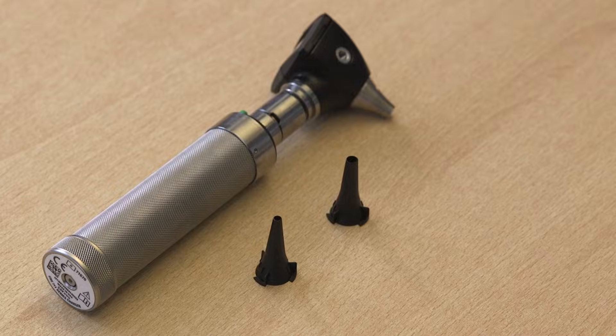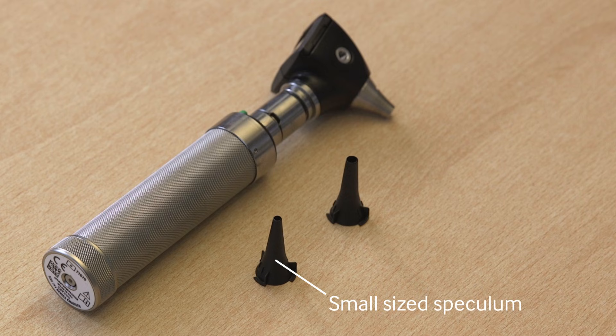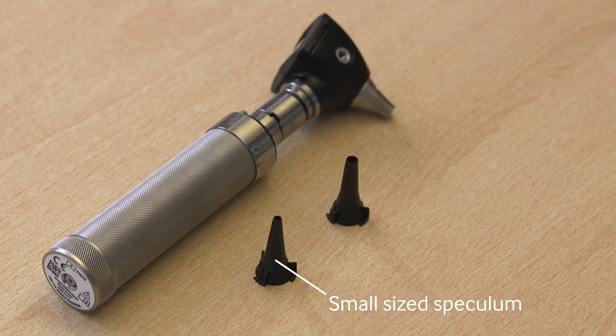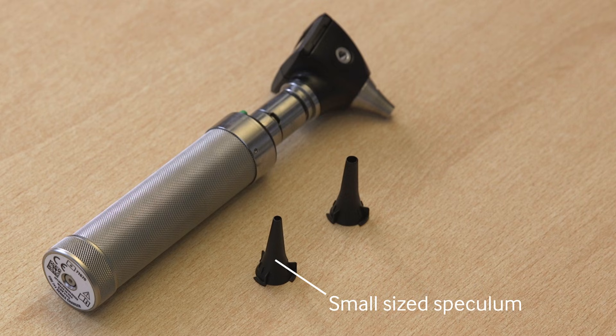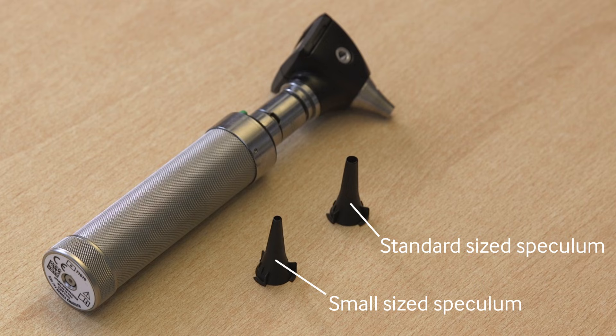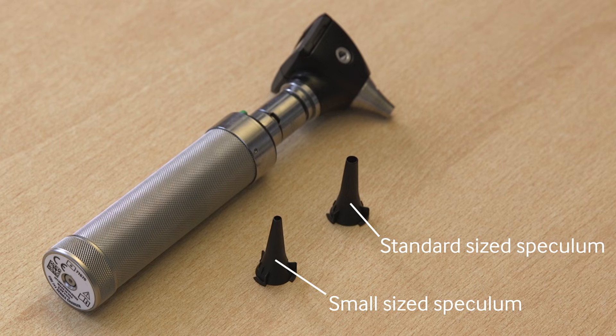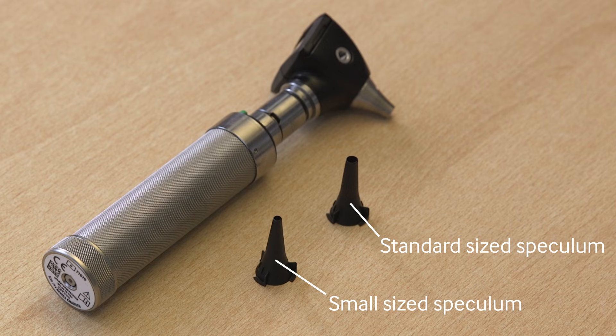There are two speculums available: there's the small one, which is ideal for children or for adults with narrow ear canals, and then there's the standard size which we can use for most adults, and this gives the best view.